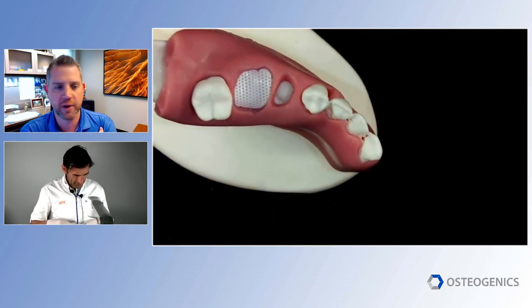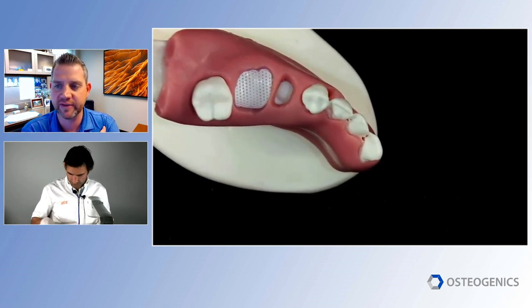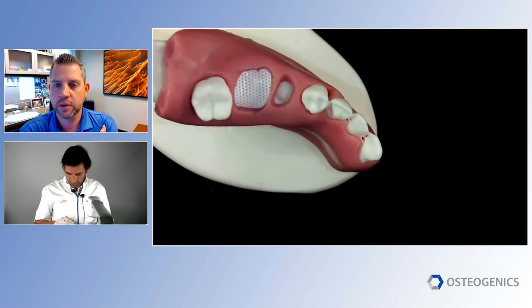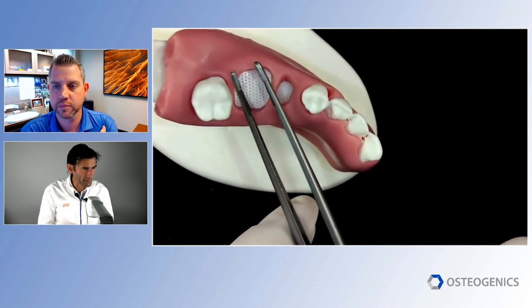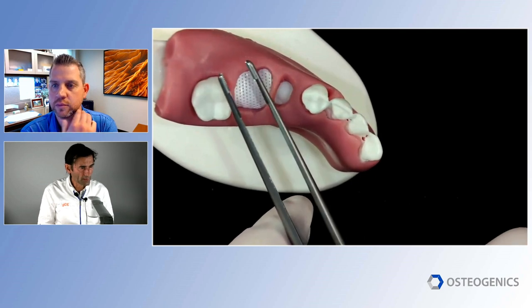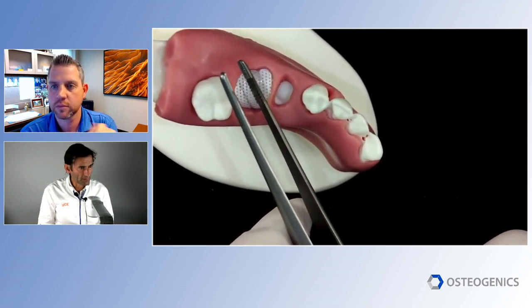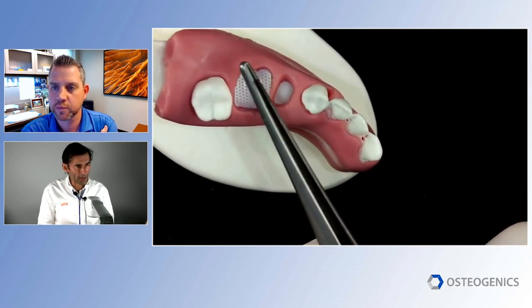Sascha, we have had a couple of questions come in while you've been going. Sorry about that. One of the questions people are asking is, what tissue forceps do you like to use? Oh, good question. Yeah. So here's my favorite tissue forceps right here. Look at this one. This is a Hu-Friedy TP5090. I said to my team, give me my plier with teeth.